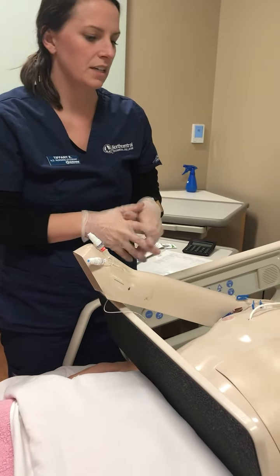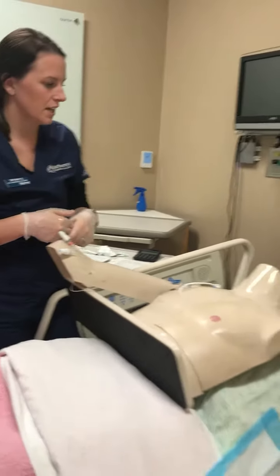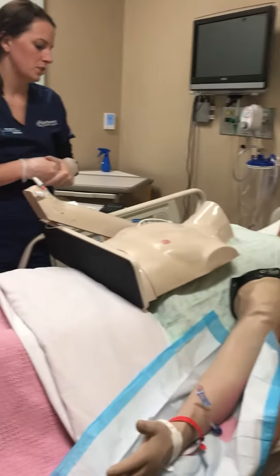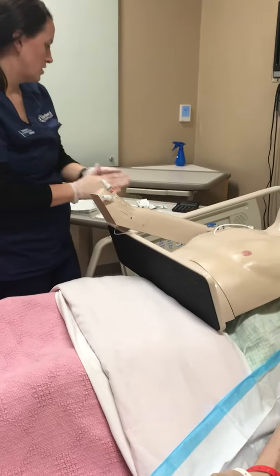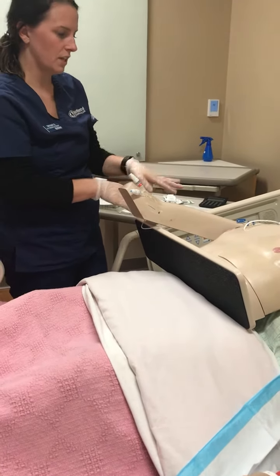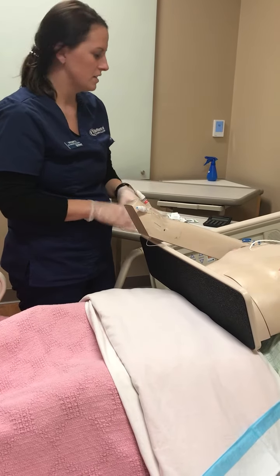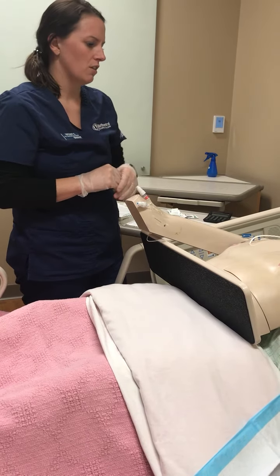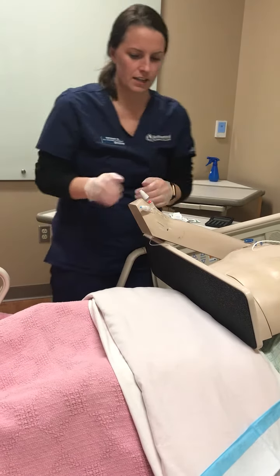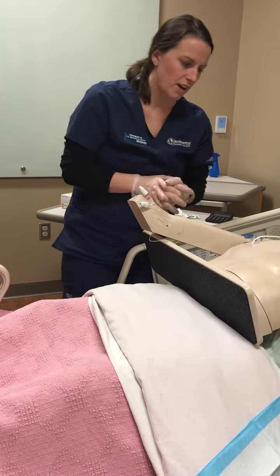Okay, and so I would reassess Mary, and I would see if she's having any reactions. I don't see anything at the site. She doesn't have any pains, not complaining of anything. I want to make sure she's in a nice, comfortable position with her head elevated, the bed in a low position, and that she's comfortable. She has a call light within reach. Her site is still secure and appears to be fine.